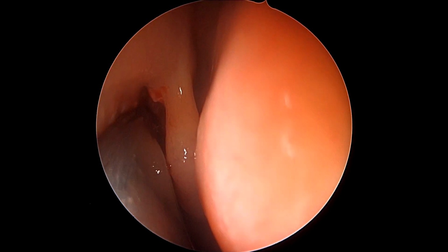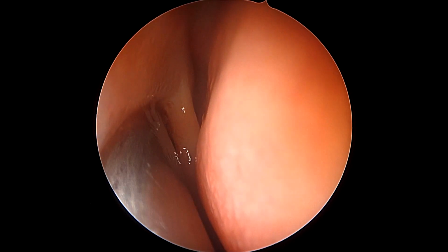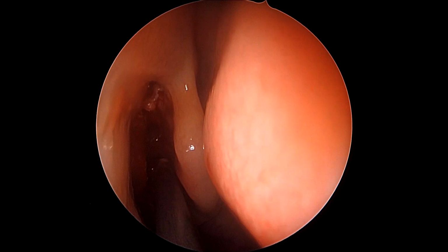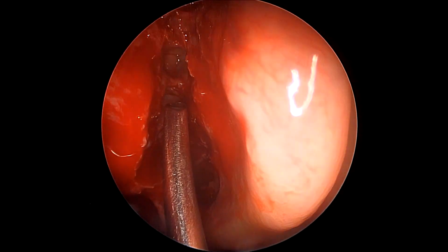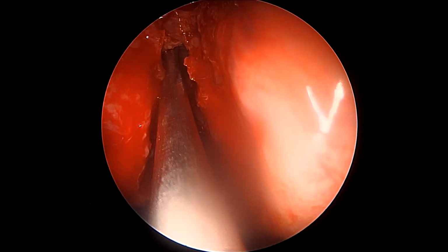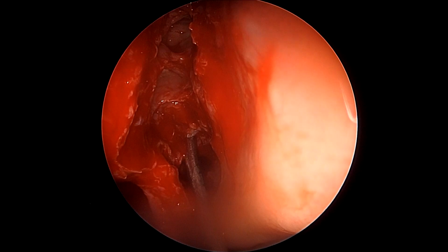Now we are using the Hajek-Kofler punch to bite off some of the anterior wall of the agger nasi. This could be done as a standalone procedure, or sometimes, as Peter Wormald advocates, using an axillary flap over the anterior wall of the agger nasi. This has an advantage of giving us a head-on view and working for a longer length of time using a 0-degree endoscope.